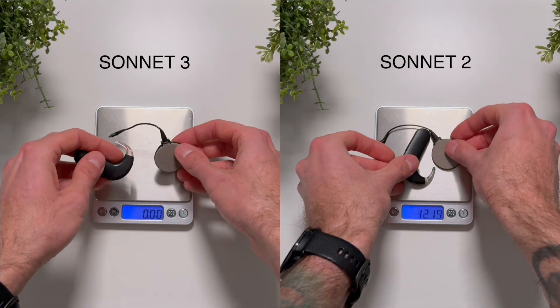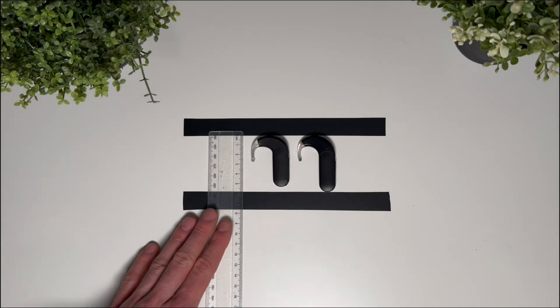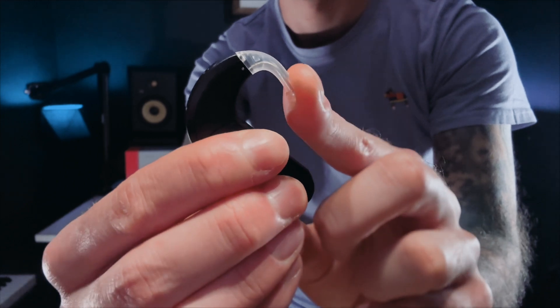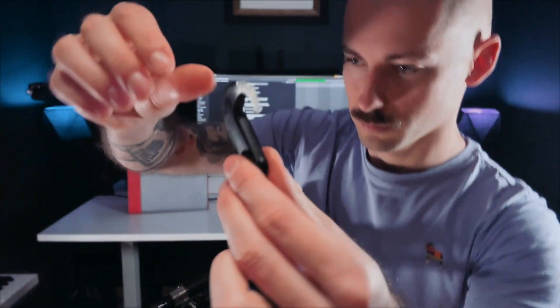Let's start with the external design. The Sonnet 3 has a lighter, ergonomic, and more durable casing. With the Sonnet 3 we also have a new flexible earhook. The new flexible earhook is pleasant to detach and you can adjust it to your needs, so there is no issue whether you have smaller or larger ears. It is much more comfortable than the standard earhook.